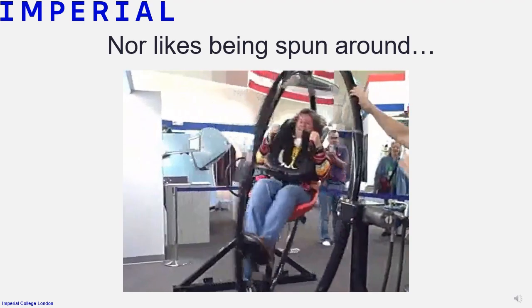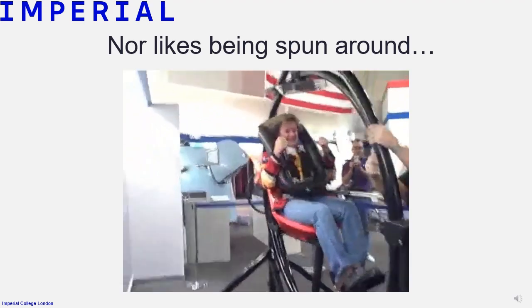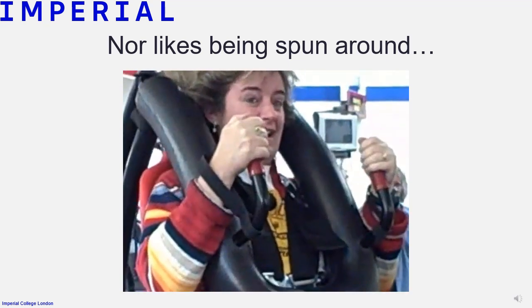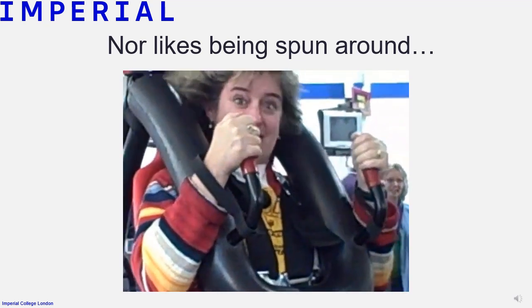Plus, I am not a fan of fairground rides or even spinning upside down. Plus, I find moving patients really challenging to scan, and I dislike vomit at the best of times. We talked the engineers out of making the patient spin around and settled for just moving the main magnetic field instead.